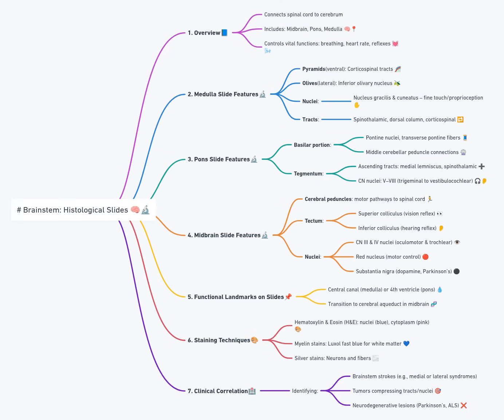Slide 8, Rostral midbrain, superior collicular level. The aqueduct has narrowed. Superior colliculi are visible dorsally as paired protrusions, their neurons forming distinct layers. Cerebral peduncle has expanded ventrally. Substantia nigra lies between crus and tegmentum, its dark melanin-containing neurons evident.